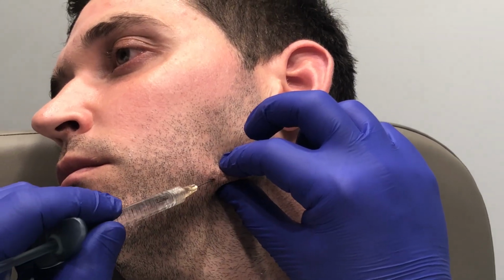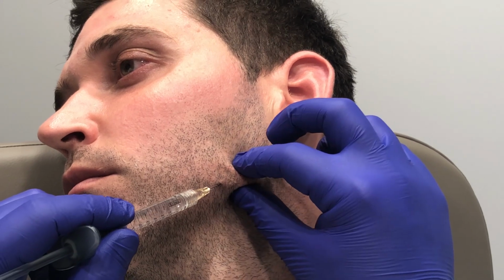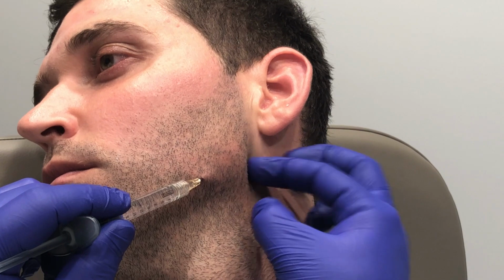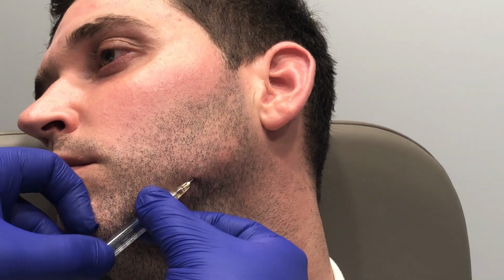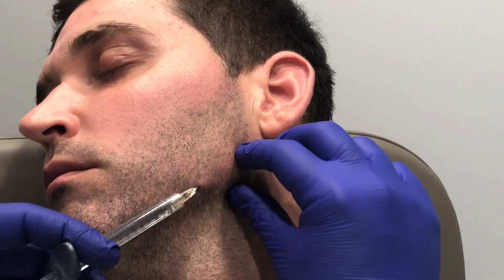And we're just going to kind of keep working our way through. Our patient, you can see, is doing really well. He's quite comfortable. And I can feel with the tip of my finger, we can actually tent and see we're all the way back here along his jawbone. And now we're going to start to just place some product, and he's doing fantastic.